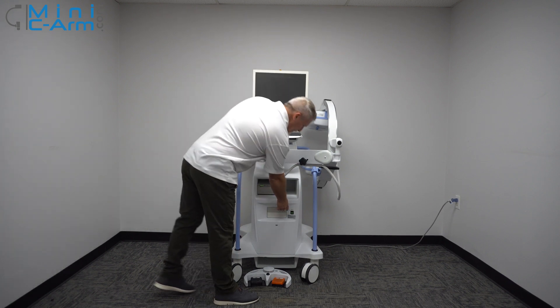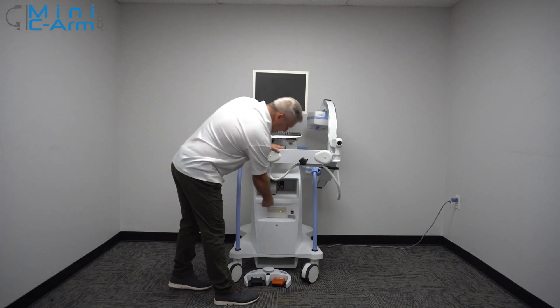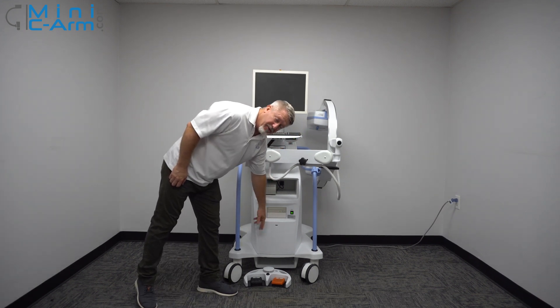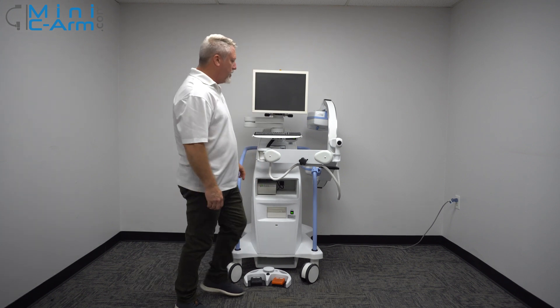To start it up, always press the green power button down here next to the DVD drive. And down here is the USB drive — a little hidden, but we know it's there.